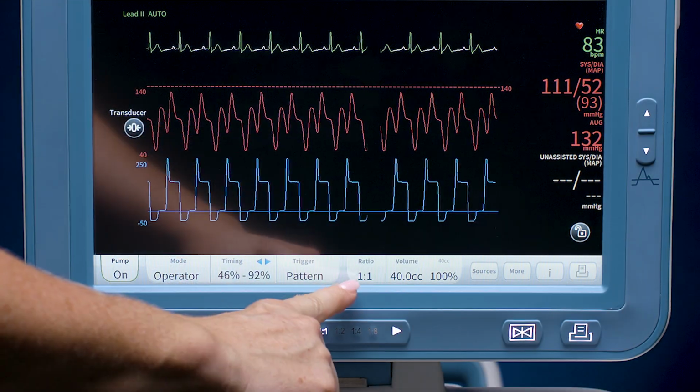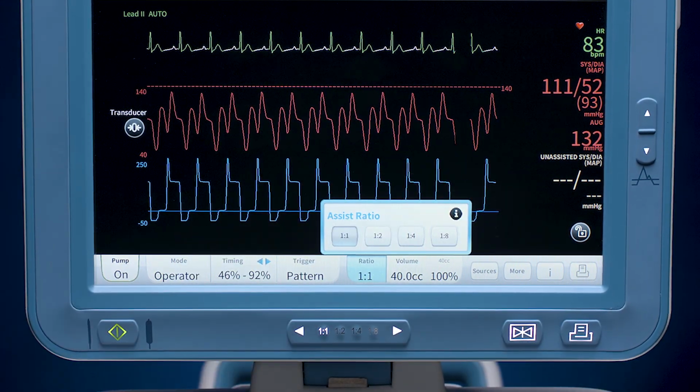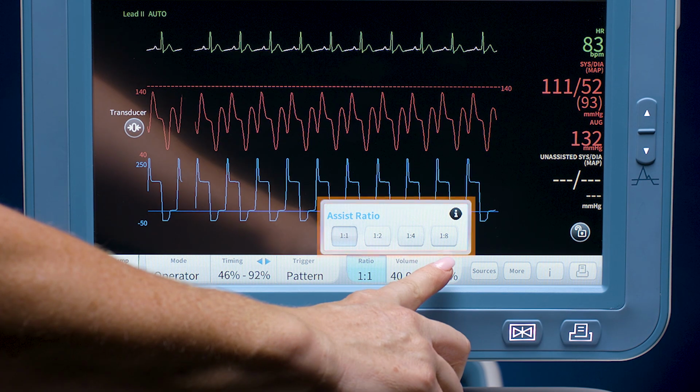The assist ratio touchscreen key allows the user to select the frequency of IABP assist the patient will receive. This function is active for both autopilot mode and operator mode. The default assist ratio is 1:1 on startup of pumping. The user now can select the desired assist ratio.